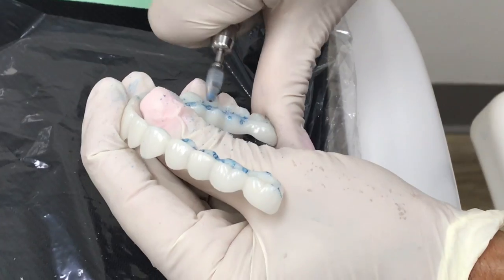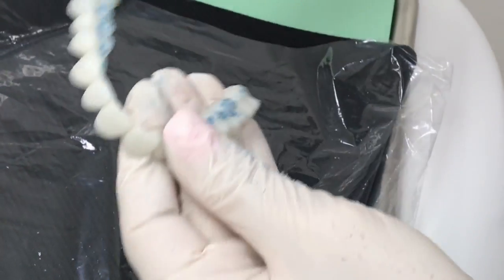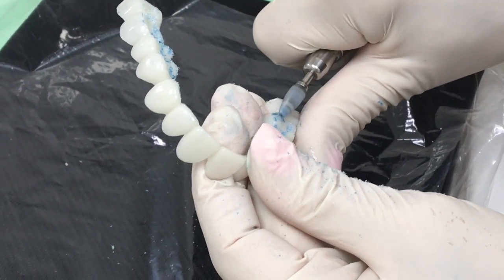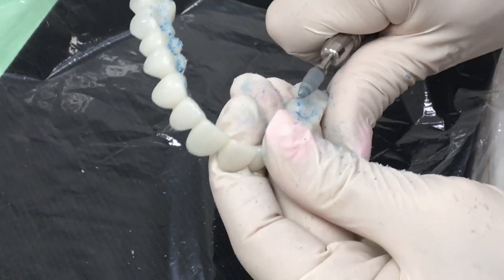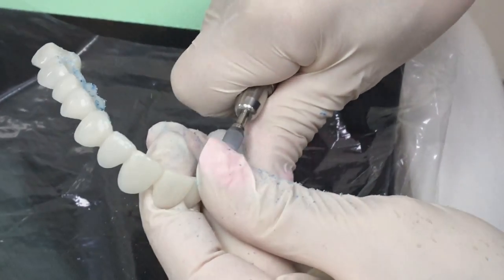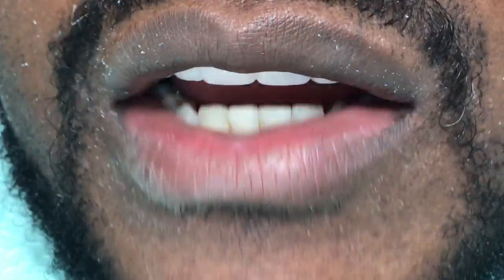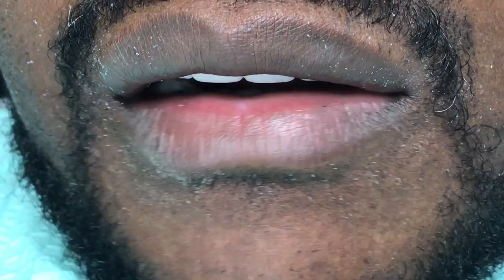So I'm going to go ahead and adjust this again. And we just keep adjusting it until the patient is comfortable. Very important part of this process. Okay, does it feel even yet? Yes. Okay, so it feels good? Yes. All right, now I want you to speak. Say church. Church. Say fire truck. Fire truck. Say 66. 66. There's a little lisp, so let me show you how to get rid of that lisp.